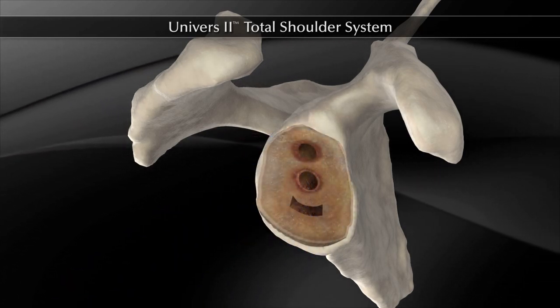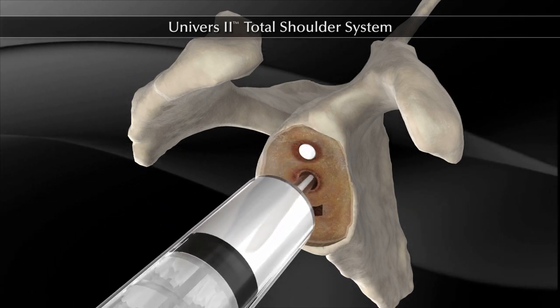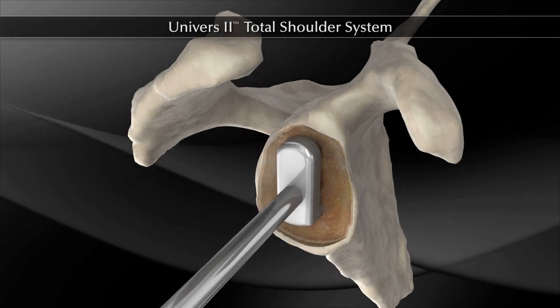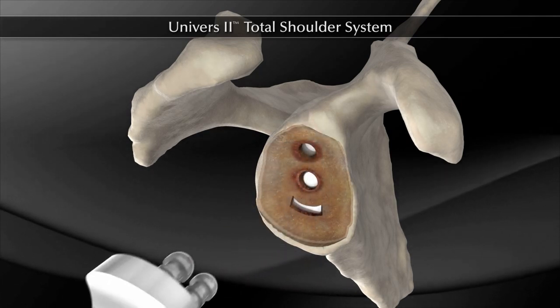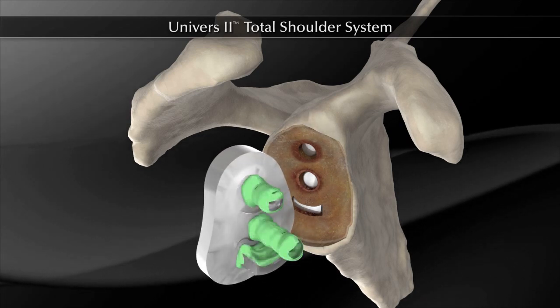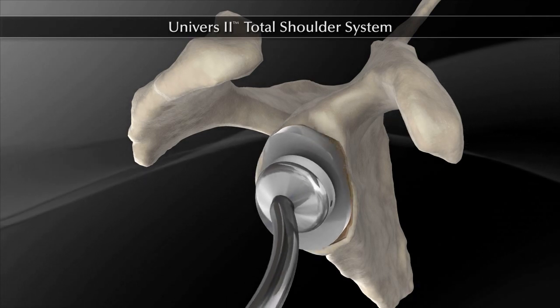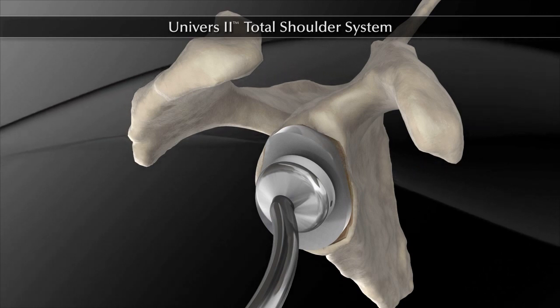Once the glenoid has been fully prepared, the keel slot and peg drill holes are packed with cement using a syringe or finger. The pressurizer tool is pushed by hand into the glenoid to pressurize cement into the prepared keel slot and peg holes. The appropriate size glenoid implant is opened and bone cement is pressed into the keel fenestration and around the pegs. The implant is pushed into the cement-filled glenoid vault and impacted. The glenoid component is held firmly in place until the cement has cured.